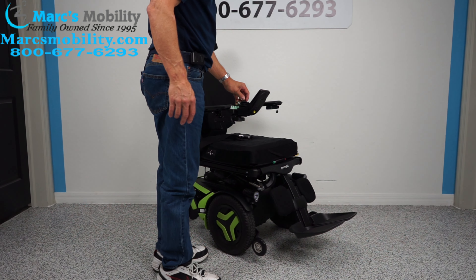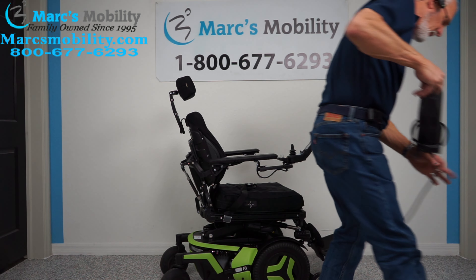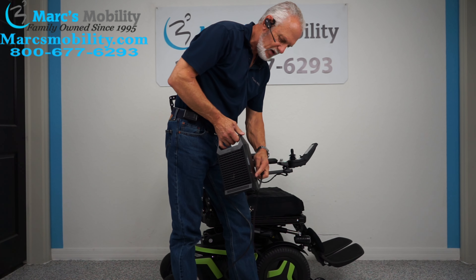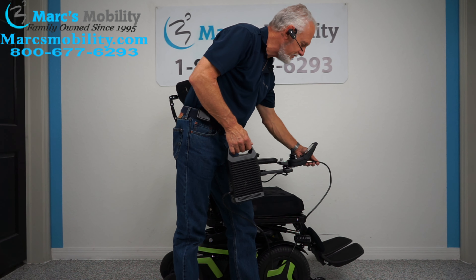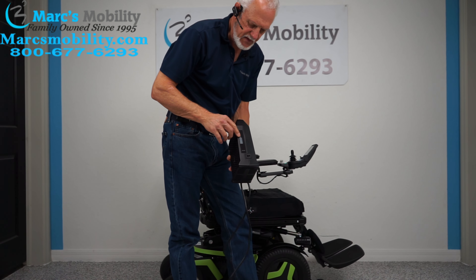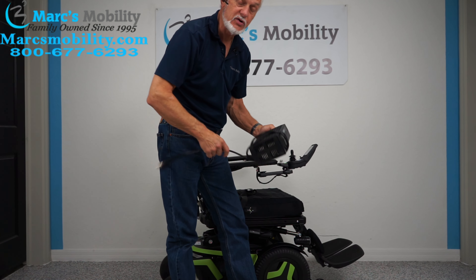When you charge this chair, you'll take your Permobil charger and plug it right below the joystick. As soon as the light goes to 100% over here, the batteries are full. Once the batteries are full, the charger will stop charging.